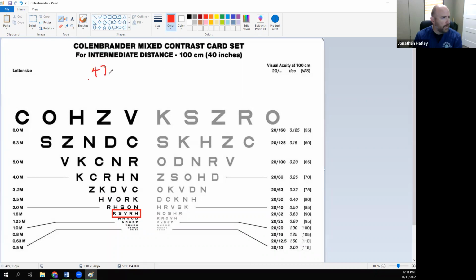0.42 over, and the line that they read was 1.6 m. And that's the way the student, or the clinician rather, should record this in the patient's chart. So let's just think of an example.